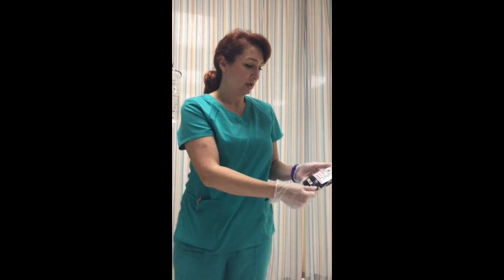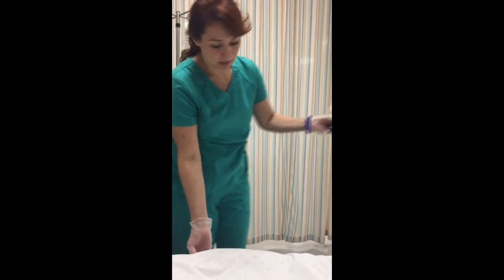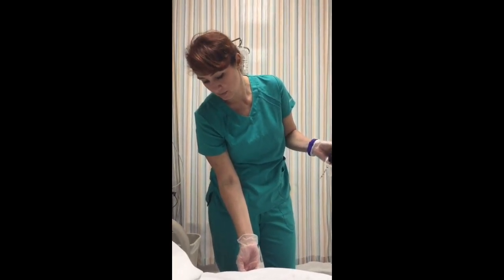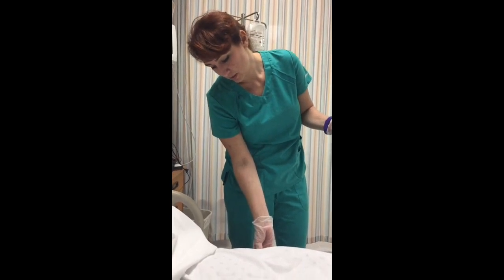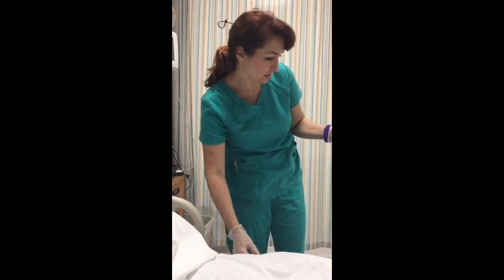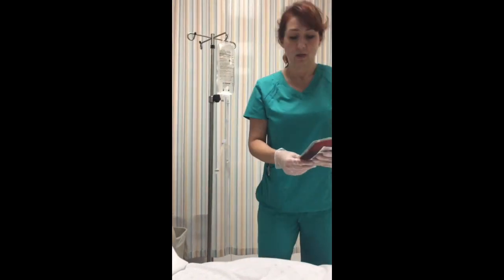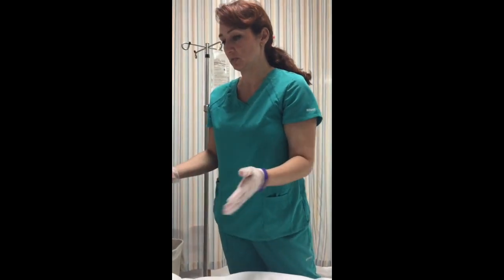We also have our RN here to verify. Sarah, can you spell your name for me? S-A-R-A-H. Last name? Jones — J-O-N-E-S. Date of birth? 1/1/1990. And your ID number? 6-0-1-1-6-6-2. We want to make sure this type-and-cross number matches the one on her armband — WTH-5-1-1-0. The RN is confirming it matches. We've verified everything. Now we're getting a set of vitals: blood pressure, temperature, pulse, respirations, and pulse ox. Everything looks good, so we have a baseline set of vitals.